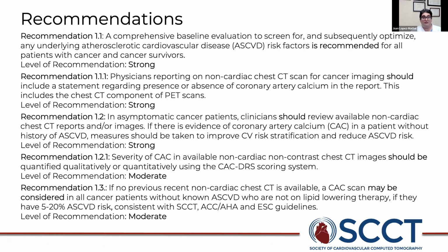Recommendation 1.3: if no previous recent non-cardiac chest CT is available, a calcium score may be considered in all cancer patients without known ASCVD, who are not on lipid lowering therapy, if they have an intermediate ASCVD risk. And this is consistent with current guidelines, and the level of recommendation is moderate.